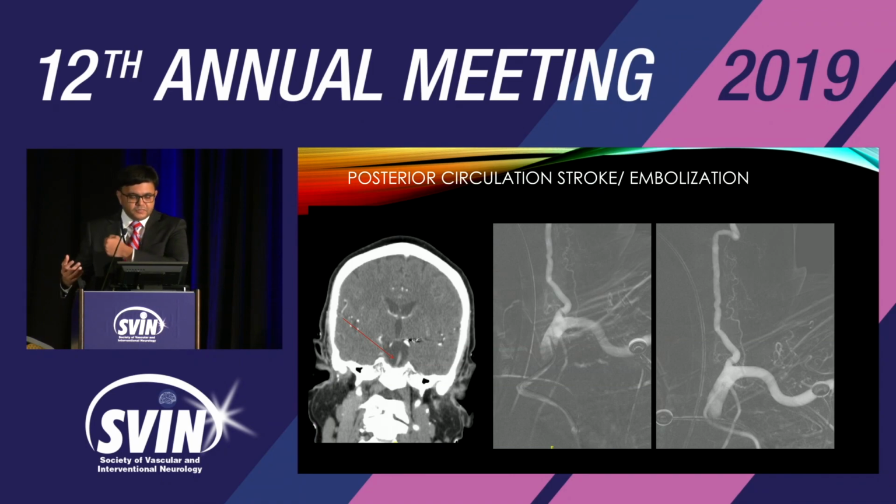You have to get the hand all the way across, all of that. So we said, fine, let's go femoral, 2 a.m. in the night. We're all exhausted. And we fight for 15-20 minutes. Every time you put the catheter up, it will fall down. As soon as you put your intermediate catheter, it just falls down.